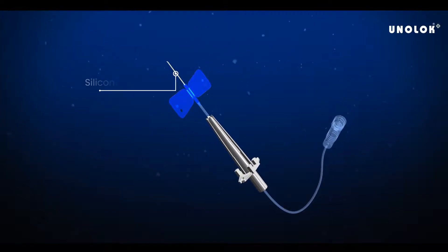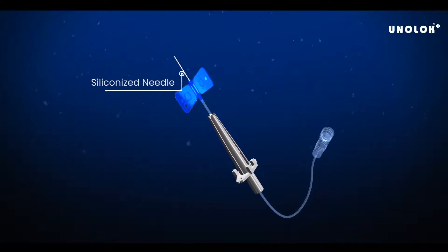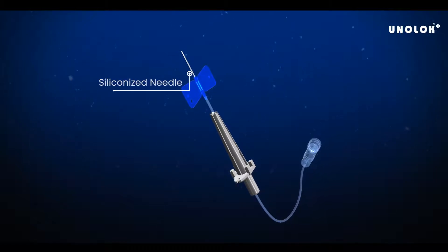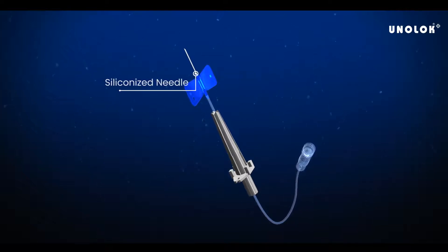The sharp siliconized needle has a short bevel. It is subjected to computerized grinding and 100% digital camera inspection to ensure sharp, consistent, high-quality needles to facilitate comfortable insertion.